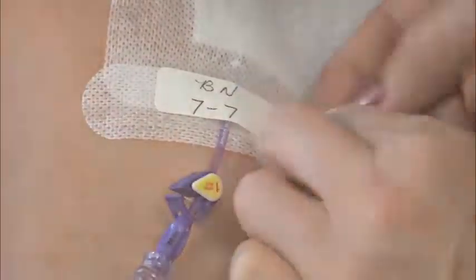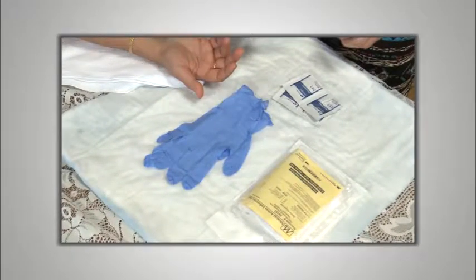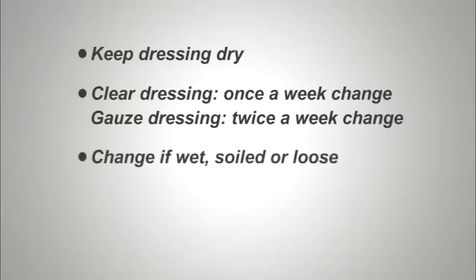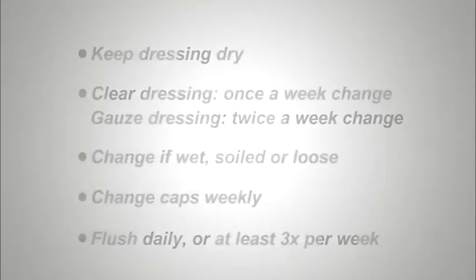You are done. Let's review some of the most important points. Before changing your dressing, make sure you have all the supplies you need. Keep the dressing dry. Protect it with plastic wrap when bathing. Never submerge it. Change the dressing once or twice a week as instructed. In addition, change the dressing if it becomes wet, soiled, or loose. Change the connector cap every week when not in use. Flush injections are usually given daily or at least 3 times each week.